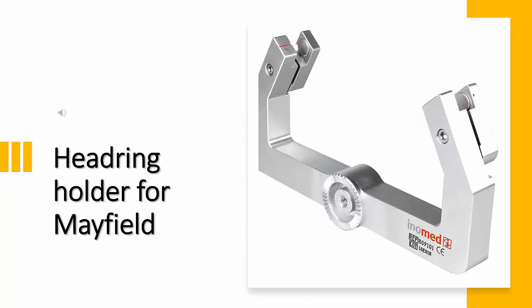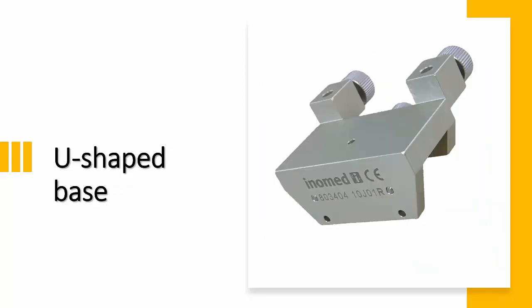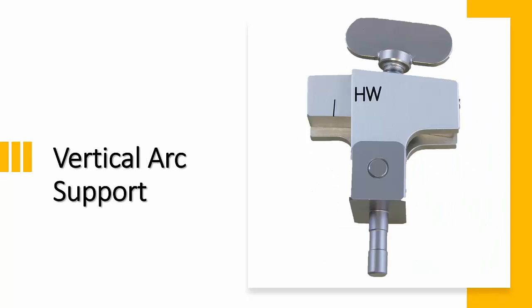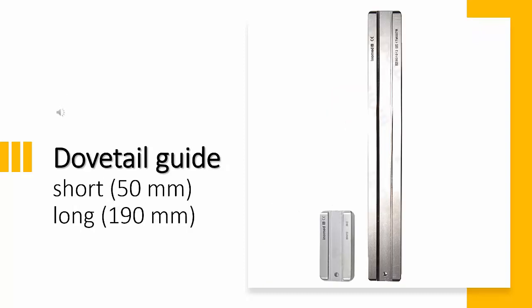The Mayfield clamp affixes the stereotactic system to the operating table. There are various sizes of vertical arcs: 90, 110, and 145 degrees. There are two types of dovetail guide — the short one is 50 millimeters and the long one is 190 millimeters.